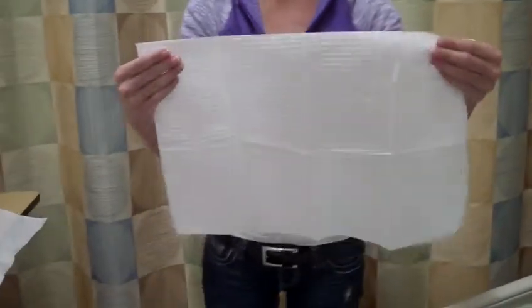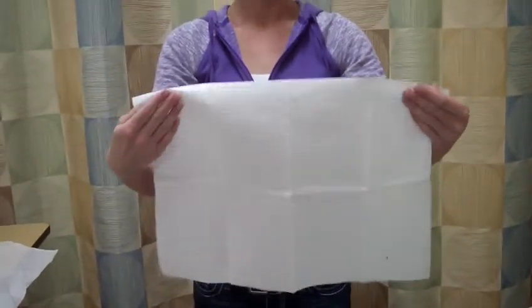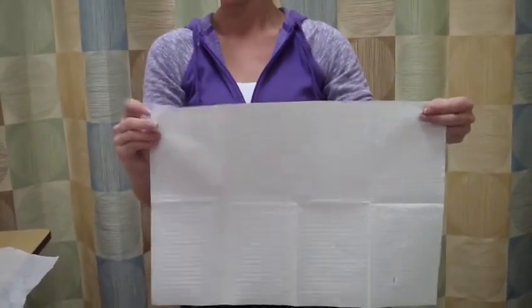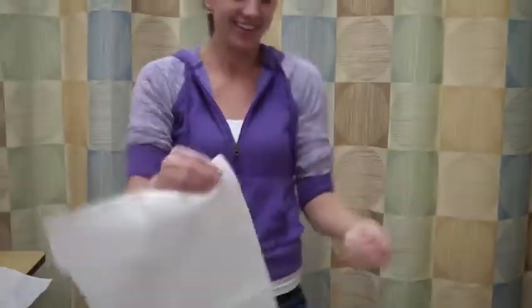I will take a clean, soapy washcloth, and in a circular motion, just going around. There we go. Throw it in the laundry.